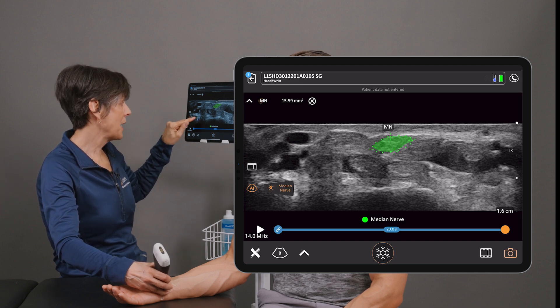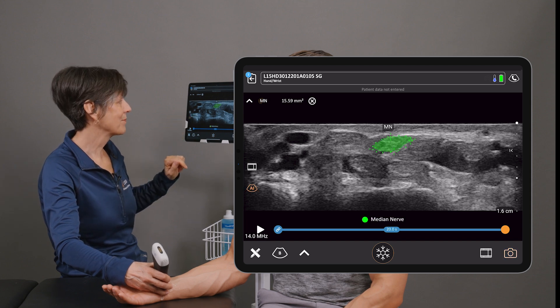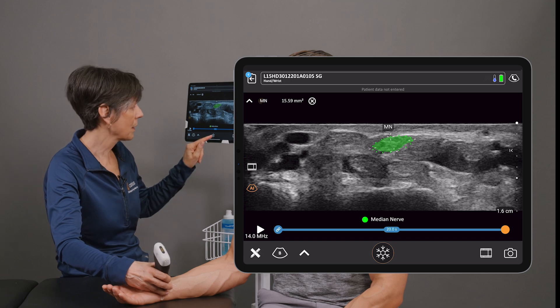I can turn off the AI, the calipers will stay, and I can turn it back on again, then save an image. As you can see, Claris made it easy for you to locate the median nerve and perform that measurement in a couple of quick, easy steps.